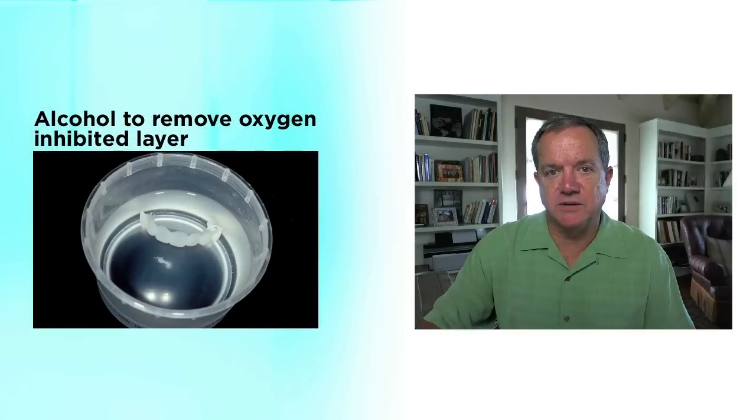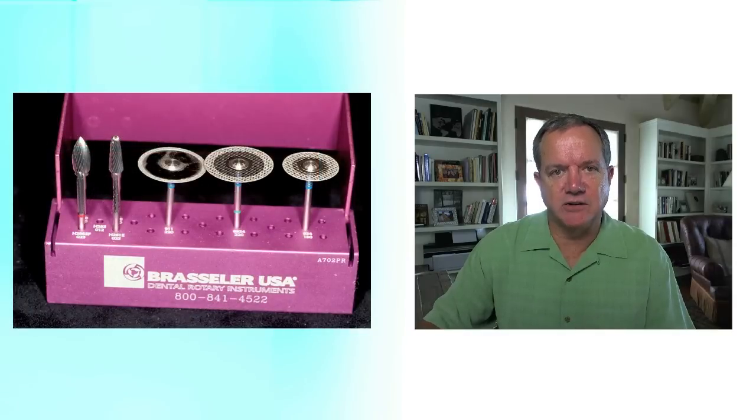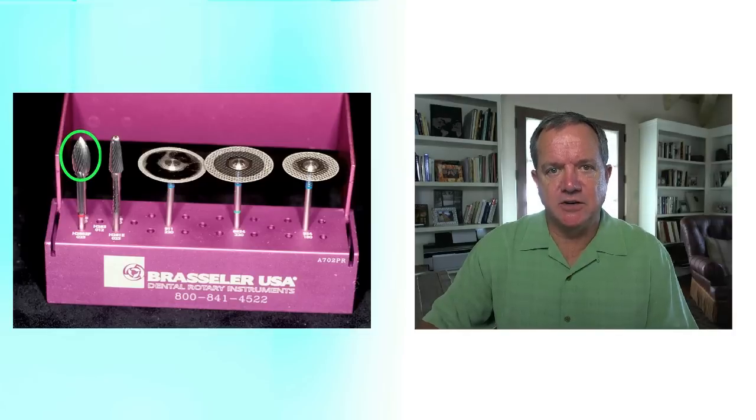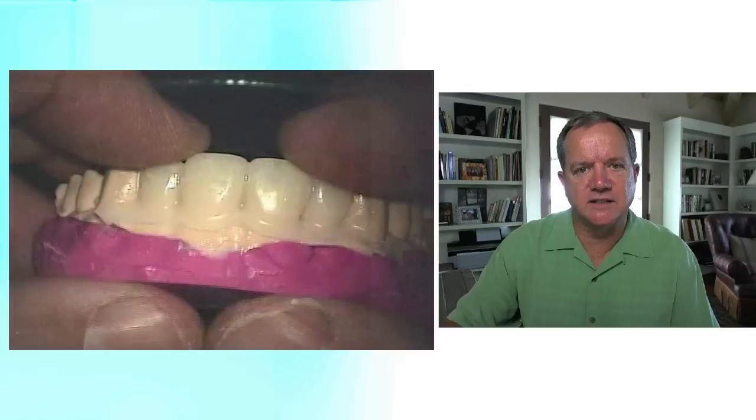Now, before I start trimming, the first thing I'm going to do is put the temporary in alcohol because it removes that oxygen-inhibited slimy layer on the surface. As far as trimming the facial and lingual margins, I'm going to use this particular flame-shaped burr. It's part of a kit that Brassler sells, which is their Spear Education Provisional Kit. So let's go ahead and work right into some videos.